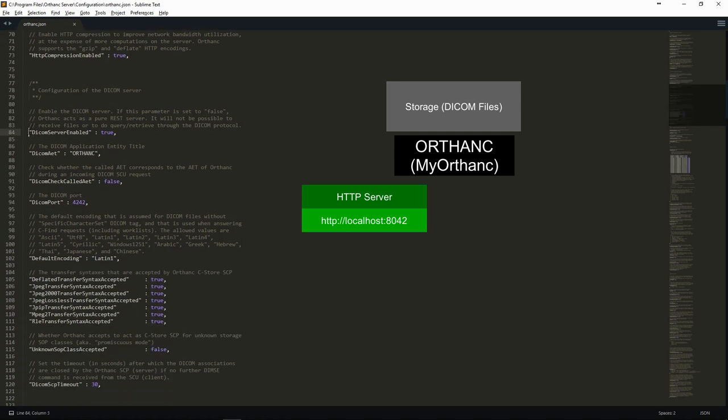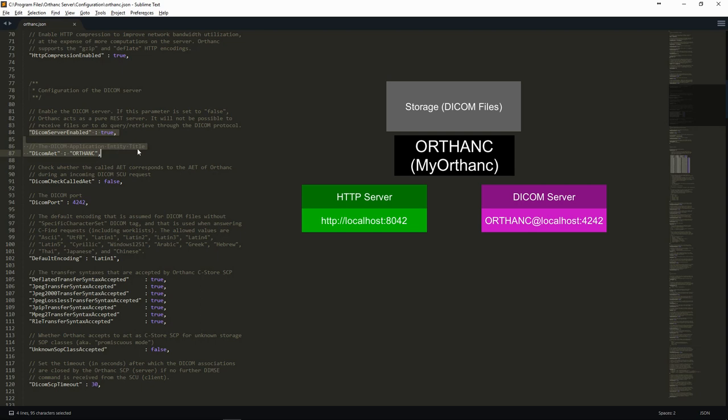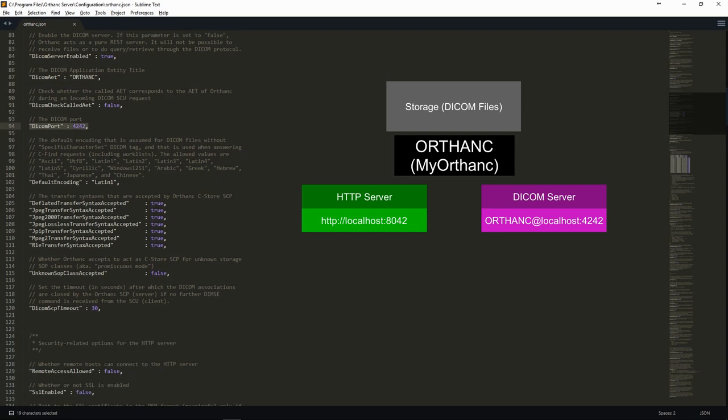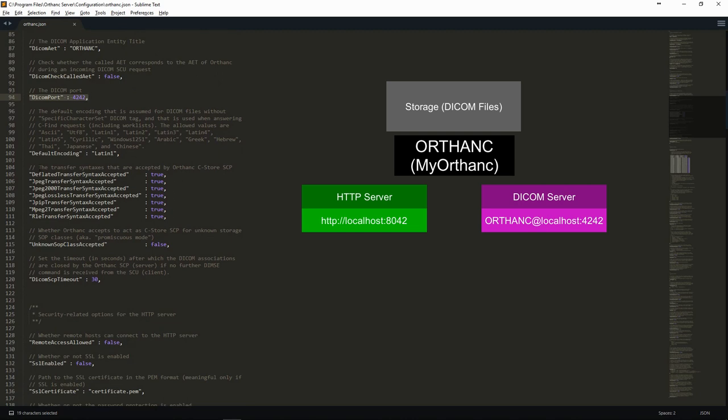In the same way, we define the parameters of the DICOM server with the application entity title of the service provider as well as the port it will listen on. We also define which transfer syntax we want the service provider to accept.